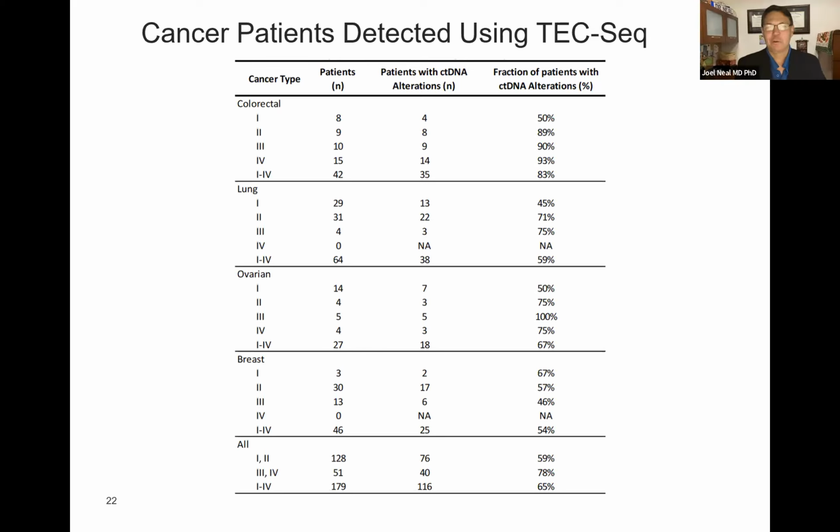Well, I mean, as Geoff pointed out, we've been running early stage EGFR clinical trials for a long time. So we've finally gotten all of our pathologists to run something on tissue. And they all have tissue because they get surgical resection by definition. So it's high quality. It doesn't matter when we get the EGFR back, but we do get it back. Okay.